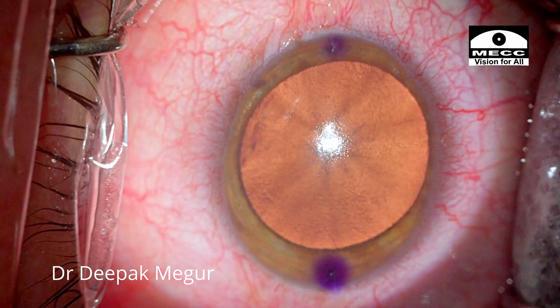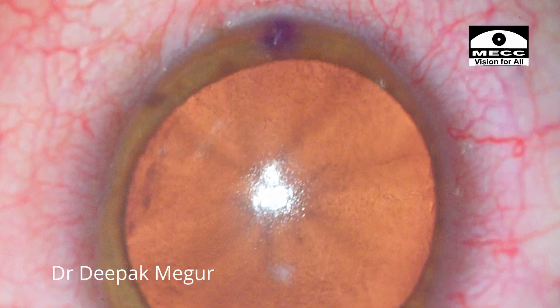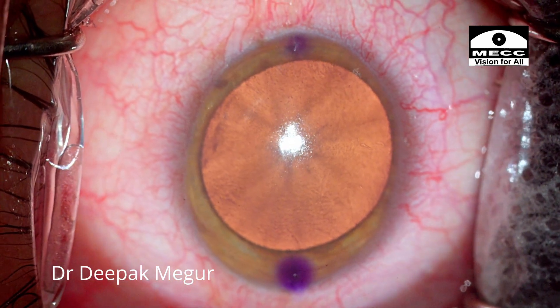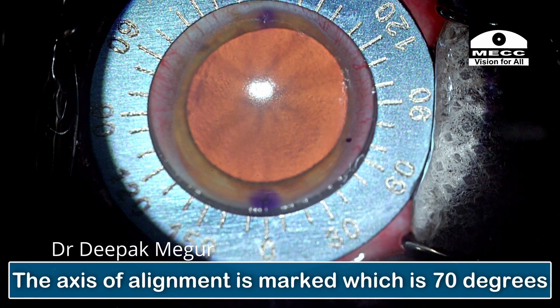Let's start the case. Unfortunately, there is ink which has spread on the side of the marking and become a little bit wider. But the presence of the punctures in the corneal stroma helps us to pinpoint accuracy, using them as the reference marks. The axis of alignment is marked, which is 70 degrees.